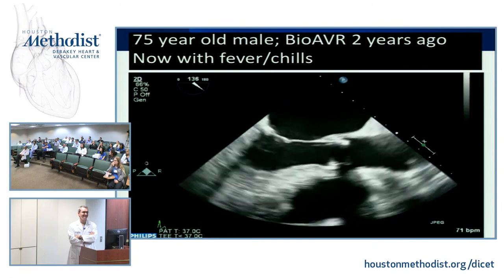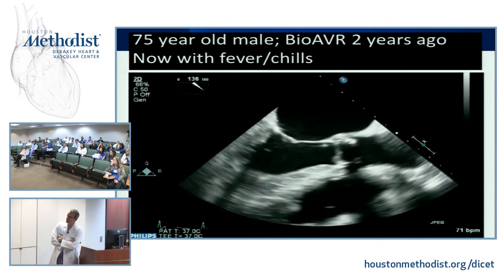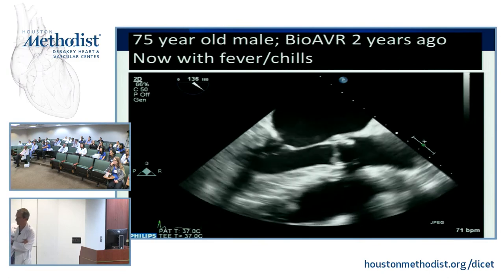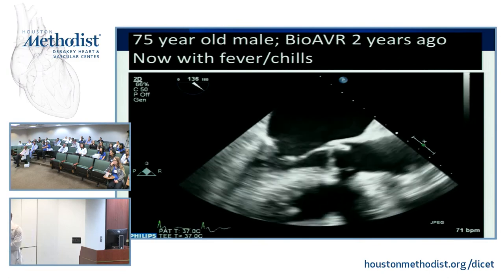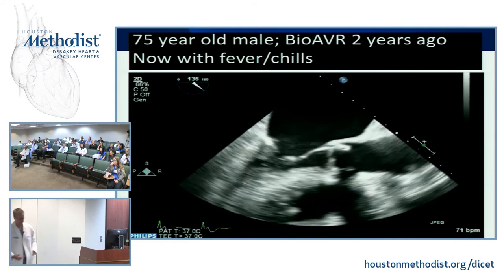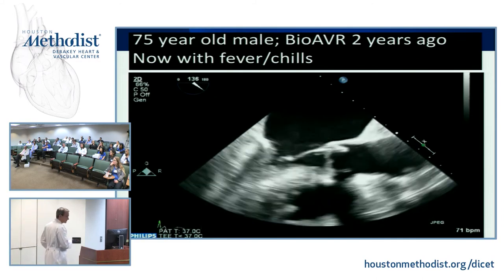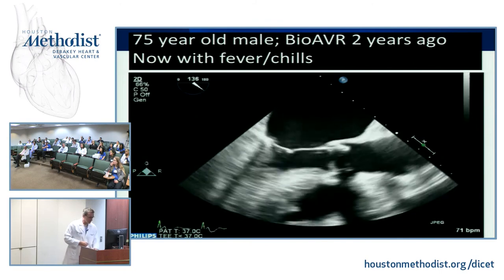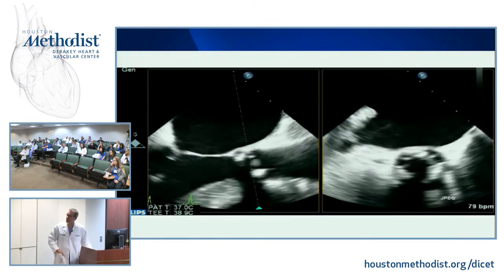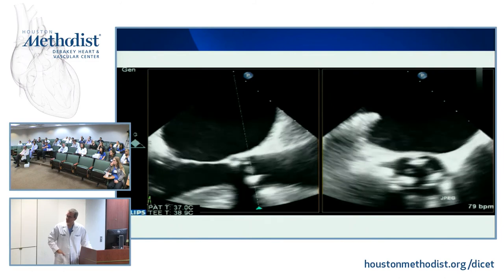Carlos. There's something wiggling on the frame, above the leaflet. Yeah, so tough, in the shadow perhaps. Not very bright. It's a good pickup. That was not picked up. This was reported as normal. Then he comes back.